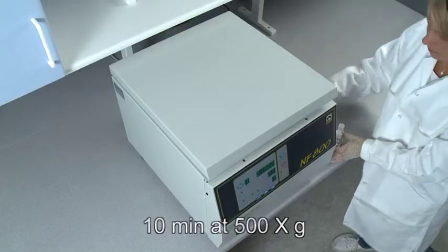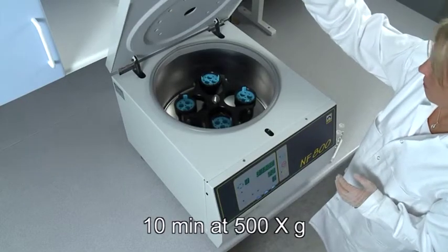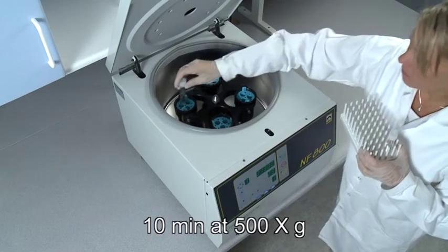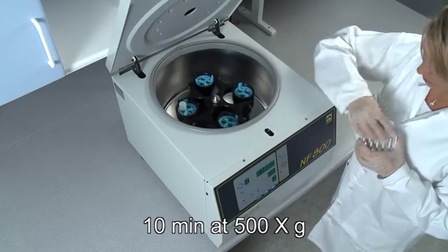Centrifuge for 10 minutes at 500 times G. Calculate the correct rpm for 500 times G for your centrifuge.